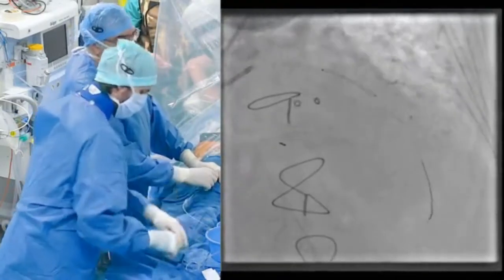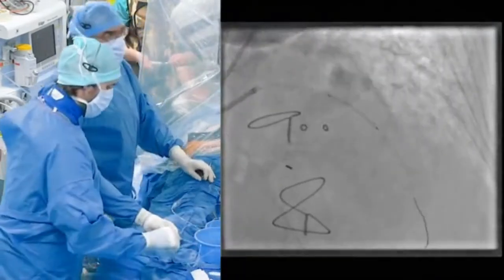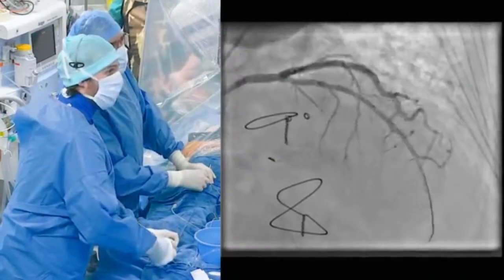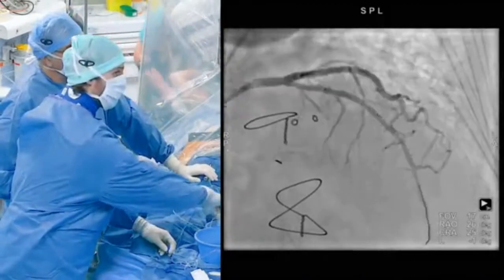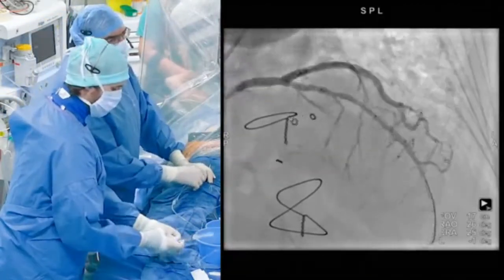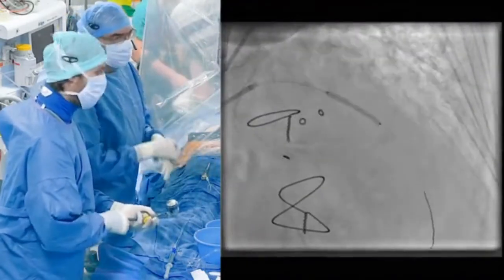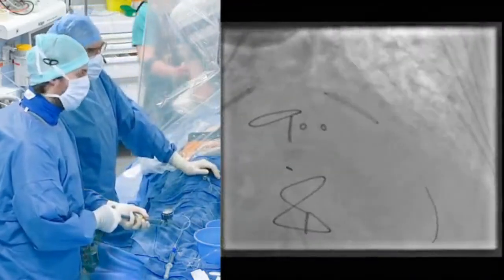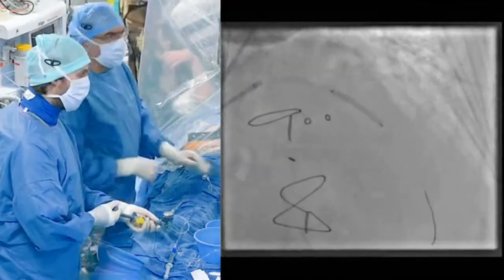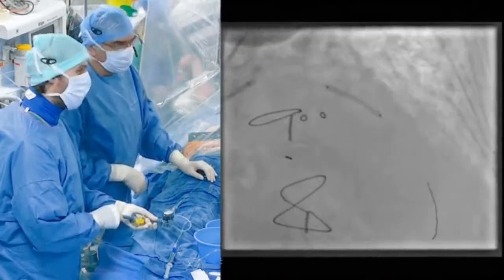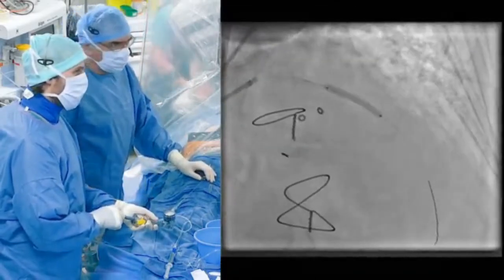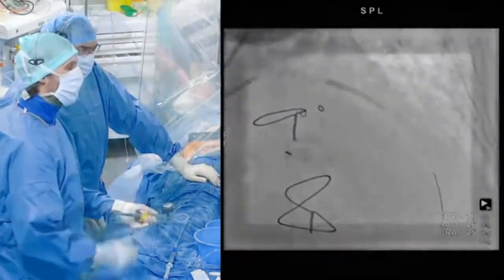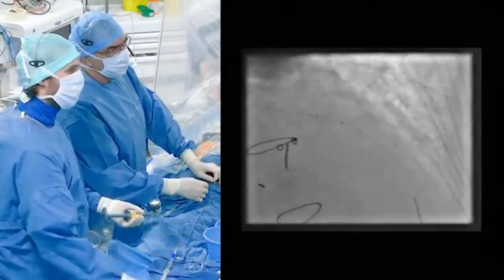Here we are. We can take a view of that. I think it's correct — the proximal lesion is covered and the distal lesion is covered. So we can inflate: 6, 8, 10, 12 atm. Okay, here we are, we can go up to 14 atm. Pressure down. Now what we could do is to pull back the balloon proximally and take 16 atm here inside the lesion.